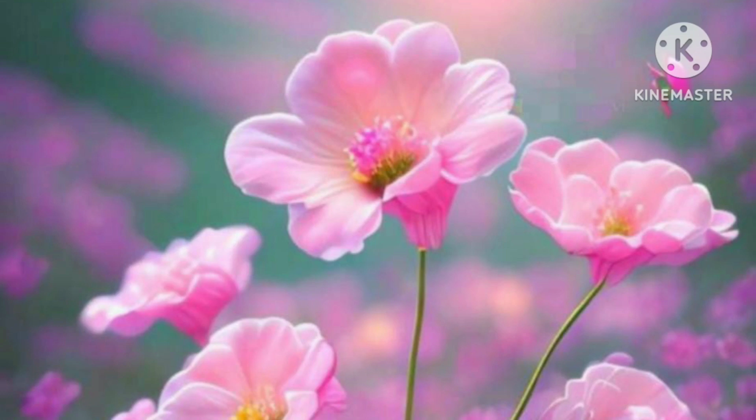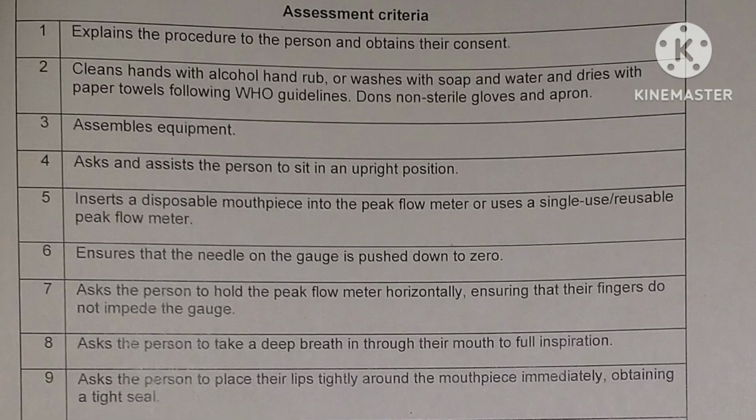Today we are going to discuss how to perform a peak expiratory flow rate skill in NMC OSCE. So let's read the marking criteria and I will explain in detail. First, what we have to do is hand hygiene with gel, then we have to assess the area for safety. We can tell, I am checking the area for safety and it's safe to approach.